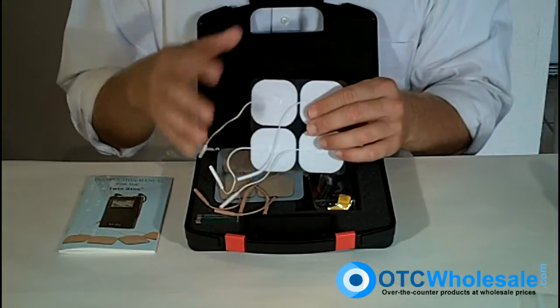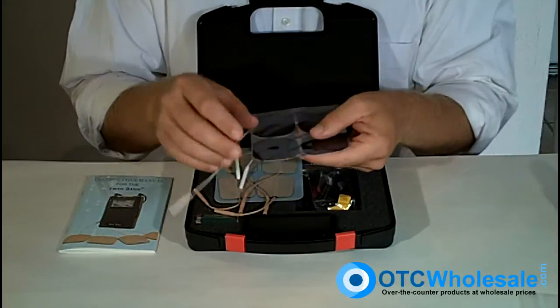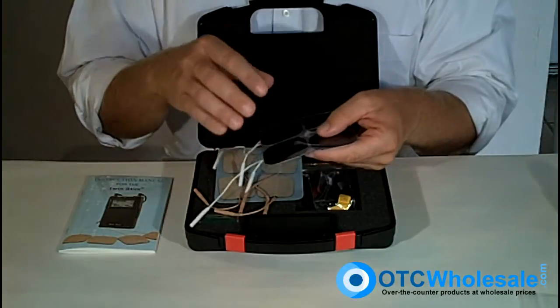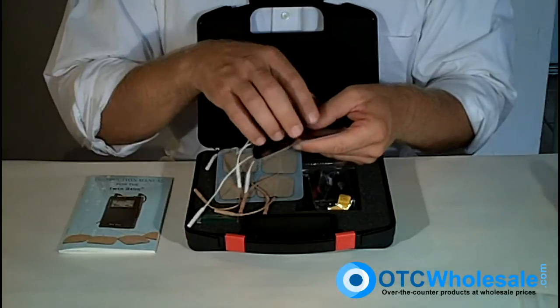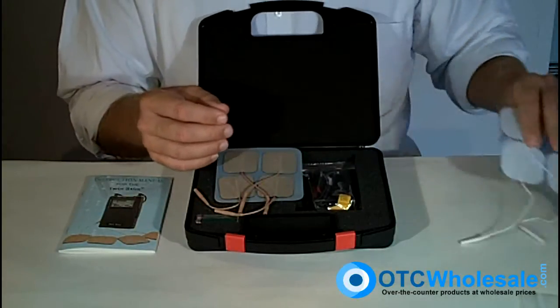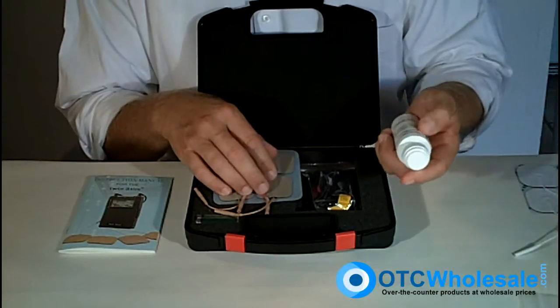Silver electrodes will keep the shocking sensation from happening. They also have an excellent American-made gel that'll be better for reuse. You're just going to get a lot more pleasure and reusability out of a decent electrode, so just spend a couple extra bucks to get yourself some decent silver electrodes rather than just using the ones that come in the package.